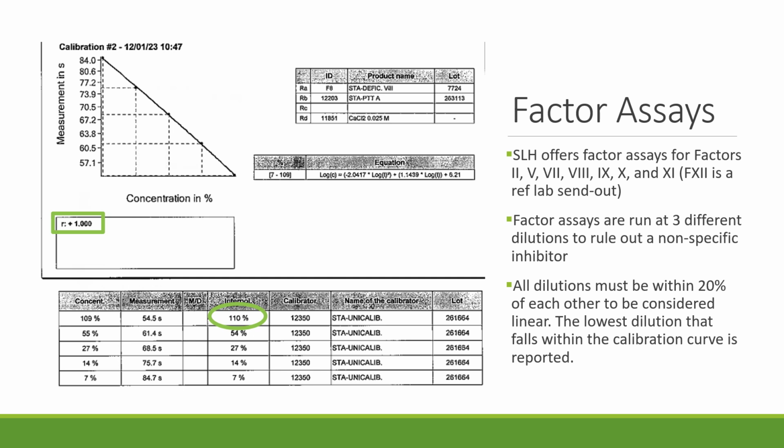But most of our dilutions are run as factors of 10. So we really have to do just a tiny bit of math, but don't worry, I will make it easy on you. Let's look at the next page so that we can determine which of the dilutions we need to report.